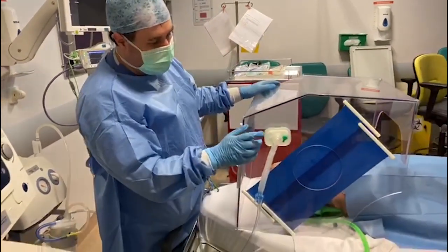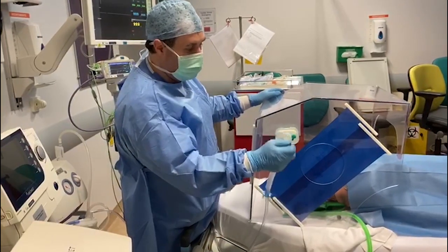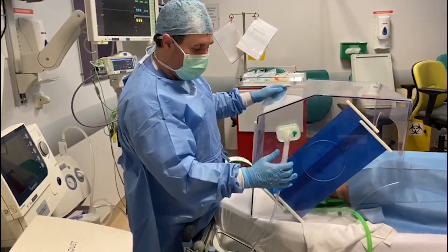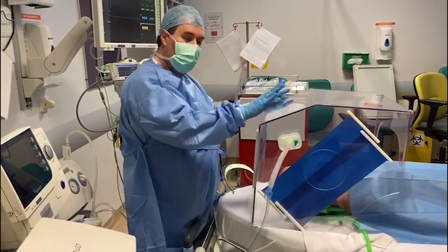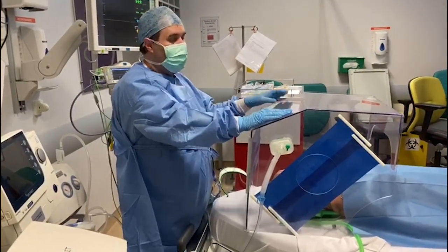Another important feature we've added is a 22mm cut-out port on the side, which will take a standard viral filter, and then just using a catheter mount, we can connect it to our wall suction so that we can potentially slowly evacuate the aerosol that will be generated during the procedure.